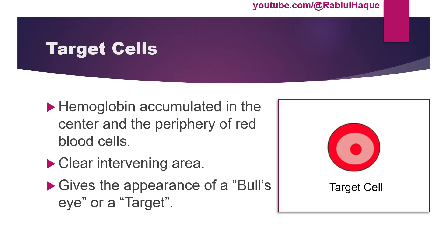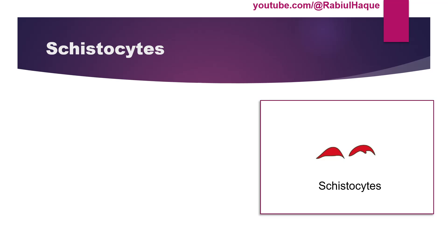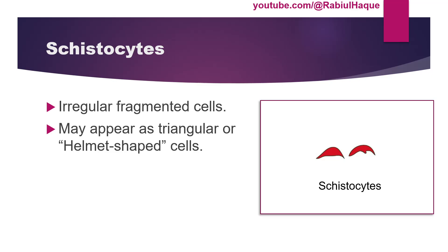Another morphology is known as schistocytes. These are irregularly fragmented cells that may appear triangular or, in some textbooks, are referred to as helmet-shaped cells. Always remember schistocytes are fragmented red blood cells and they may indicate hemolytic anemia.